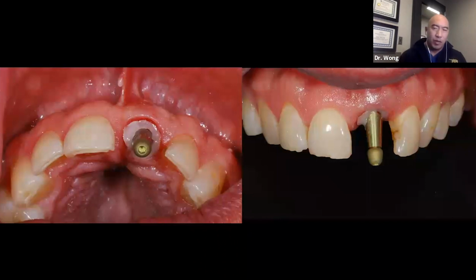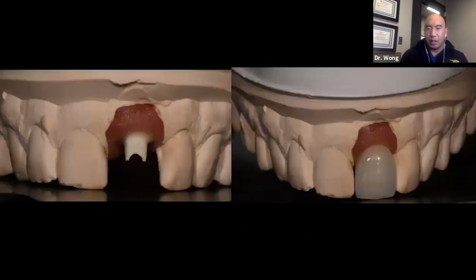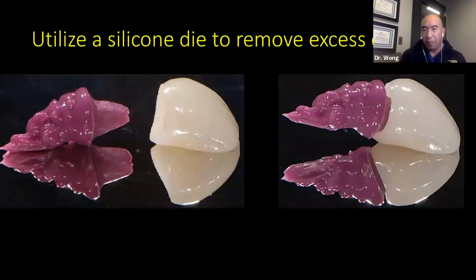So essentially, what you've done here is you've made a chairside customized impression coping. You take an impression of this, okay? This should all look familiar to you, and then you pour it up or send it to the lab. They pour it up. In this situation, they've made a cemented restoration. So here we have the abutment, and there we have the crown on the model. Okay. Now, the reason that we take an impression that way is if you look at the model, the abutment comes off and on the model very, very passively. There's no squishing the tissue, because the model is very accurate as to what we're seeing in the mouth.